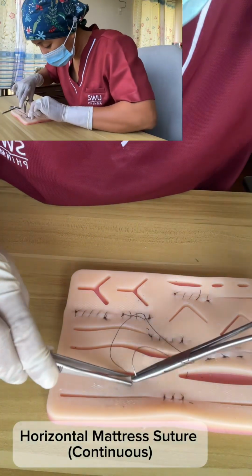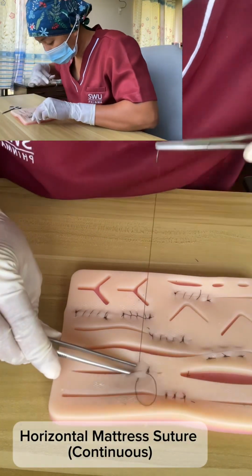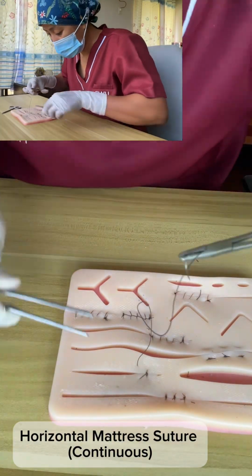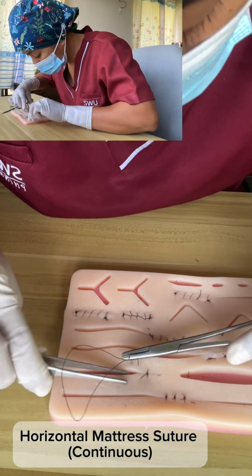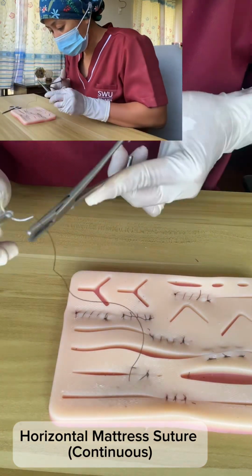It is appropriate in those areas because it provides strong tension relief, so it is useful where skin edges might otherwise pull apart. It also helps prevent suture from cutting through fragile tissues.